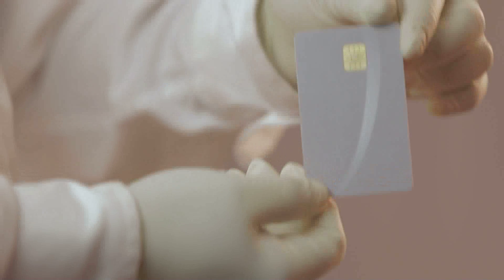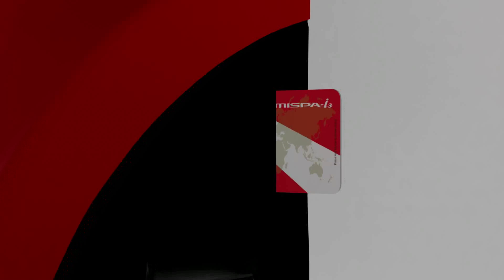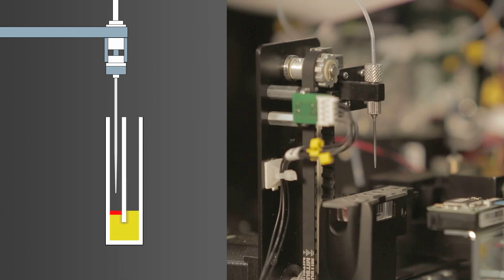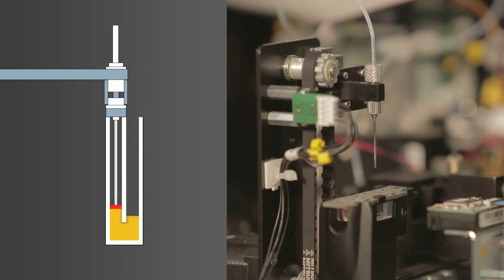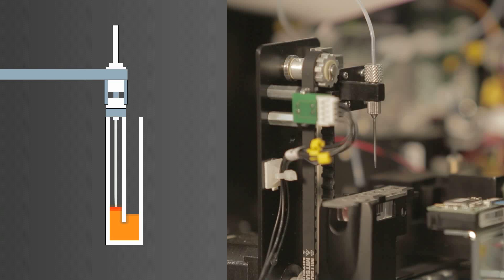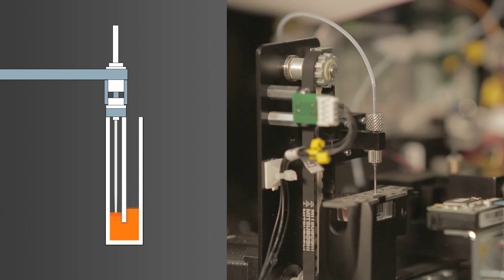The IC card is pre-programmed with assay-specific data including the calibration curve, which will reduce cost. A specially designed probe eliminates any chance of carryover or contamination and increases the speed of the system, ensuring consistent mixing and enhancing precision.